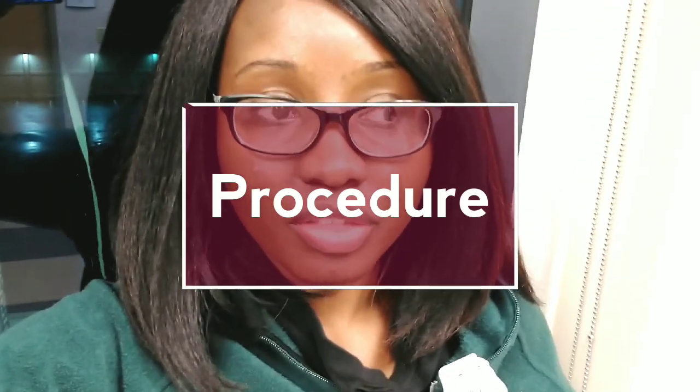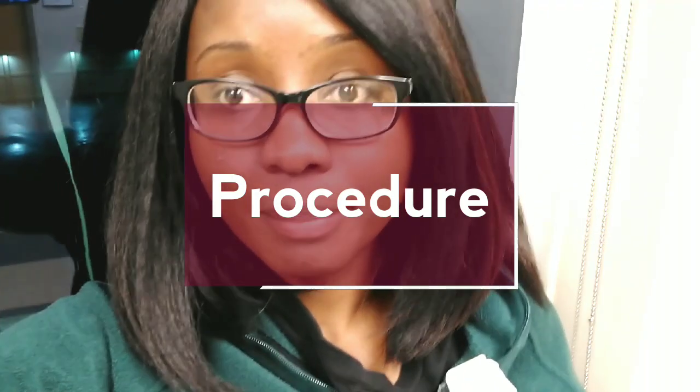Okay, so the first thing that we do when we come in is get a report from the person before us. If anything happened during the day, you have to relay it to the next person so that they can watch out for it. For example, if you have a patient that converts from sinus to AFib, or they go into VTAC or VFib, this is important information that you want to relay to the next person.